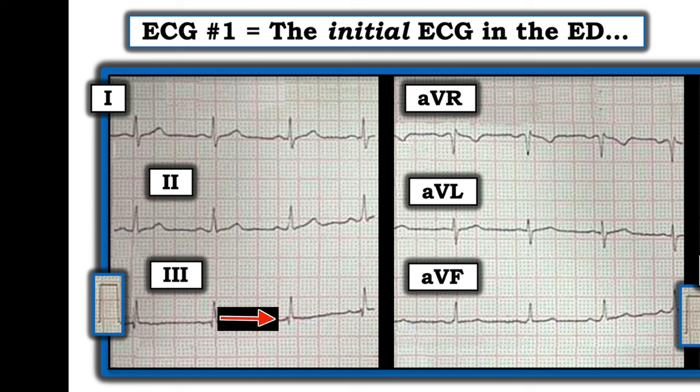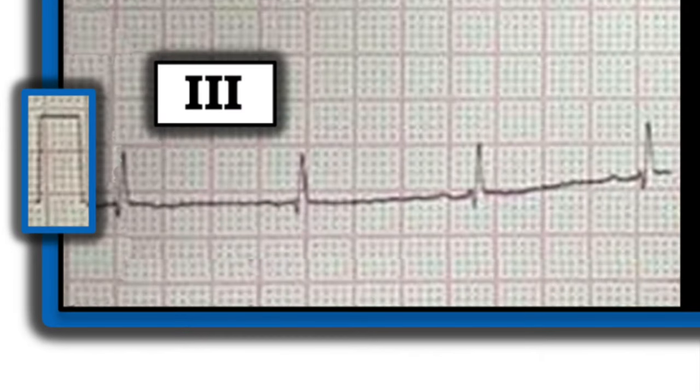And actually, this is not a Q wave. If you can enlarge this or look closer, there's a tiny little R wave. Now, some of you may look and say, but there's a Q wave here. This is an interesting phenomenon.